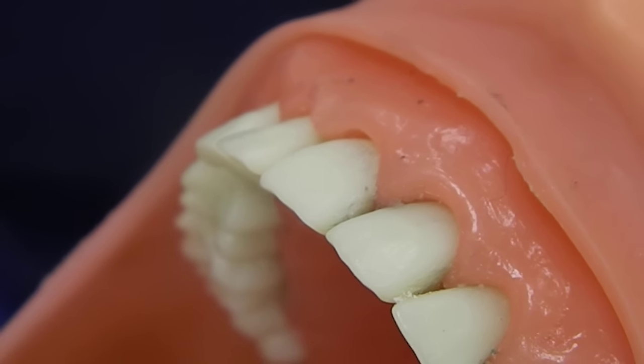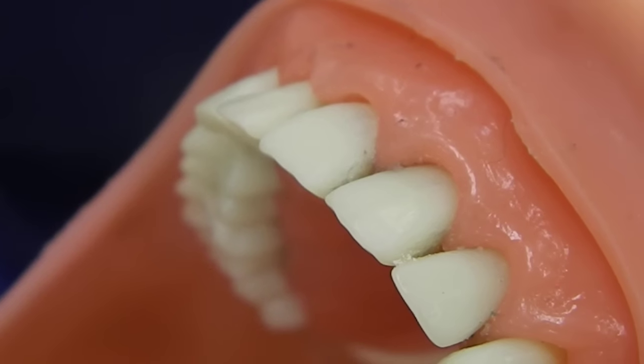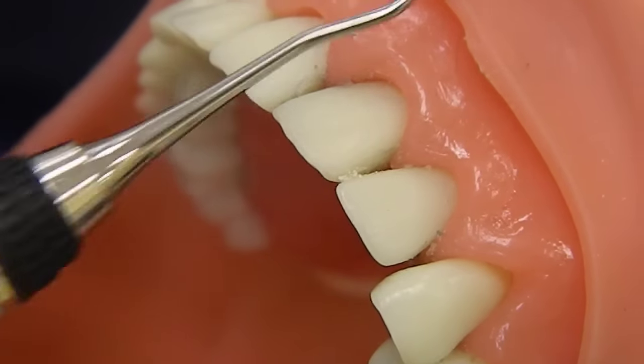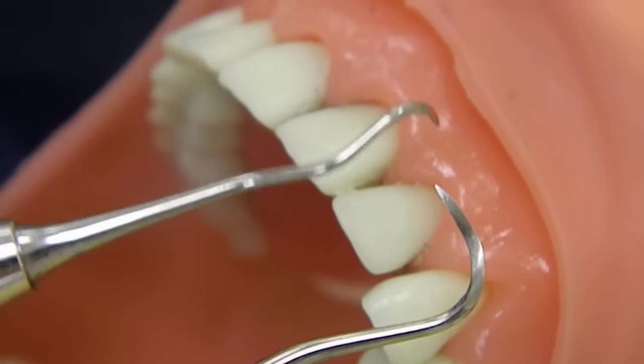This tutorial is about the sickle scalers. These are supragingival instruments — they don't go underneath the gum line. There are two to complete the full dentition: we have the anterior and posterior sickle scalers.